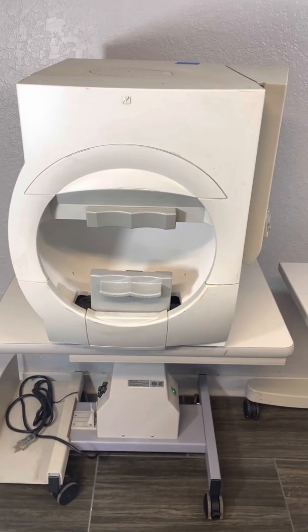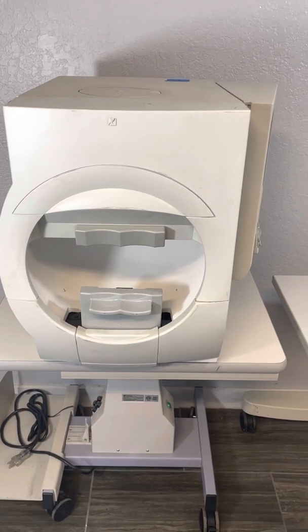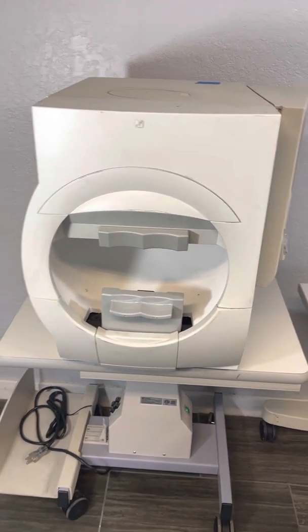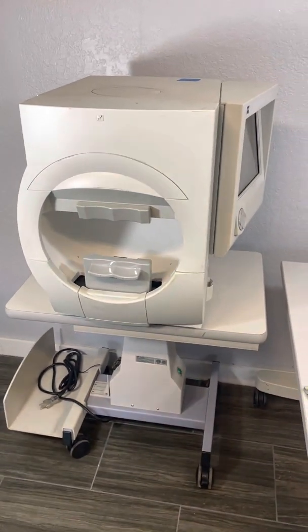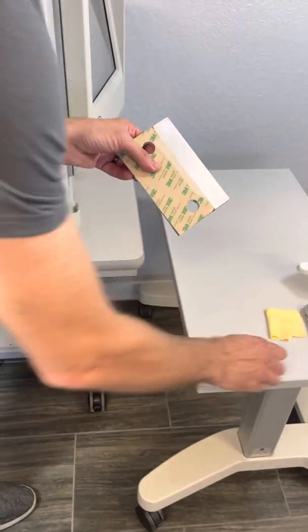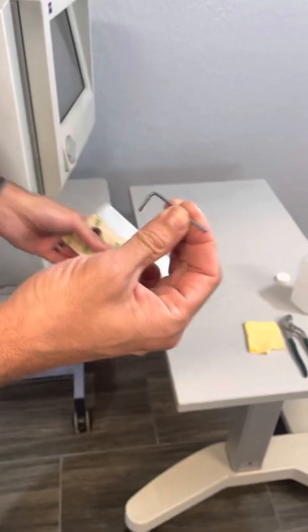This is an instructional video showing how to repair the chin rest on a visual field using the precision equipment part. In the package will come the replacement part with industrial adhesive on both sides and an allen wrench.